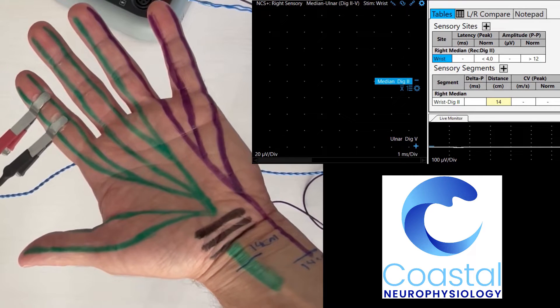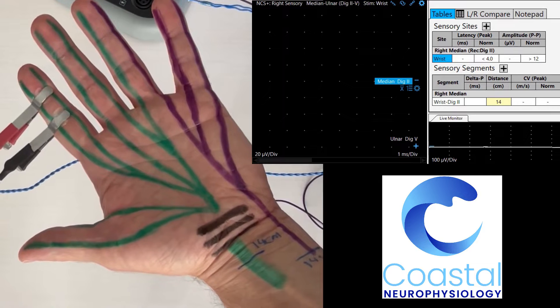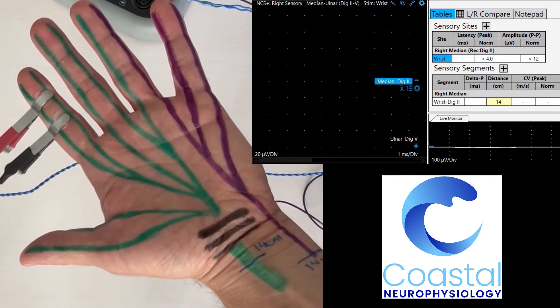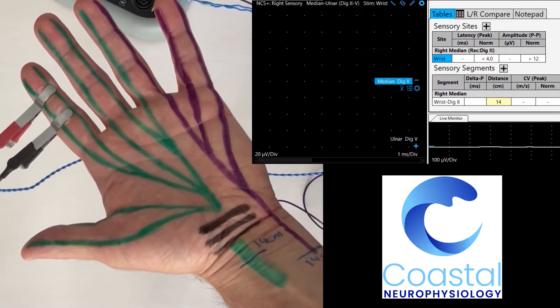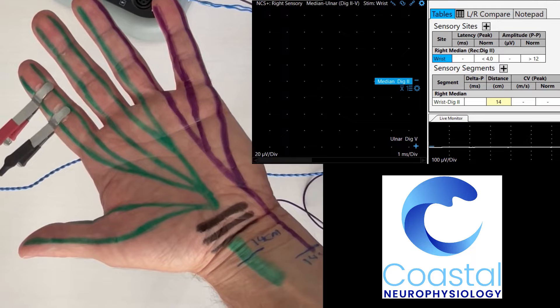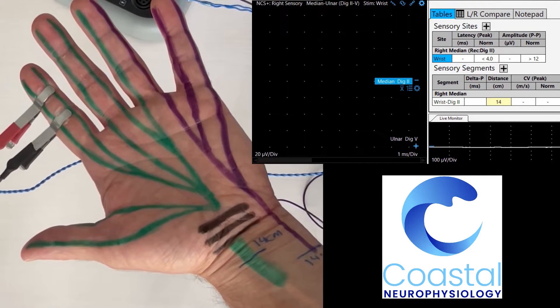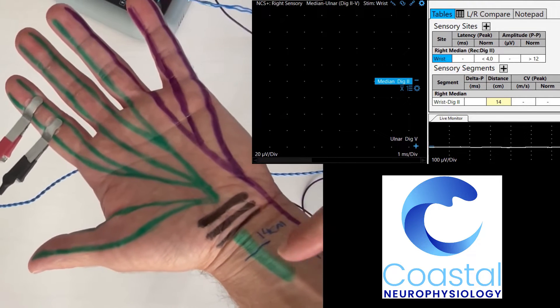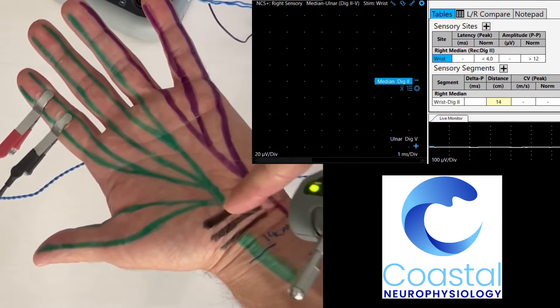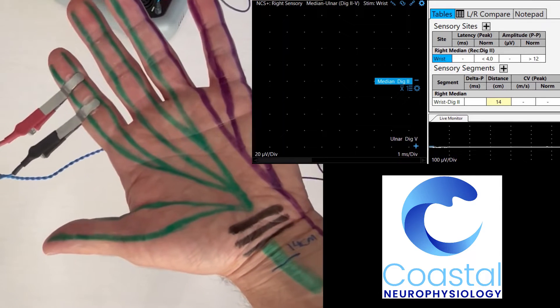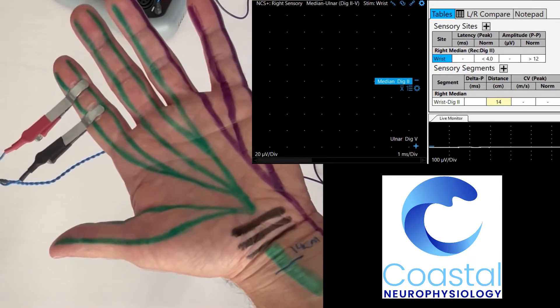There are multiple ways to test the median nerve. In this particular instance, this is a very common setup that I have ready. This is a sensory signal that I'm going to record, stimulating the median nerve here at the wrist, sending a signal through the sensory nerve fibers to a recording electrode that I have up here on my index finger.